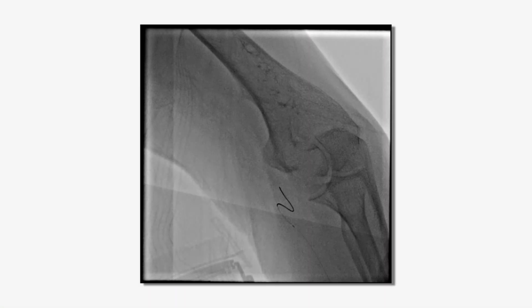As time goes on, you might want to tackle some of the tougher cases, but for congenital anatomic variations, you might want to steer away from those cases to start with. Atherosclerotic disease, loops, tortuosity, both in the radial, both in the brachial, and the subclavian.